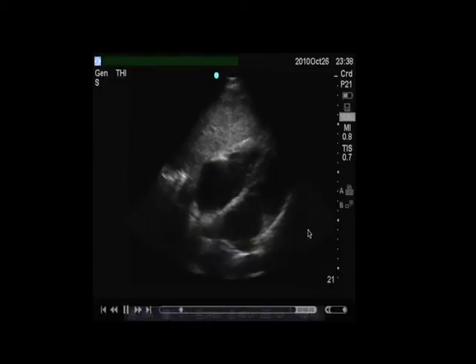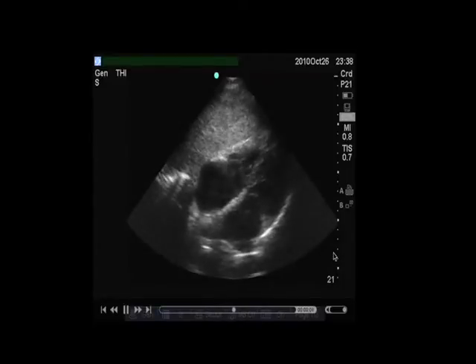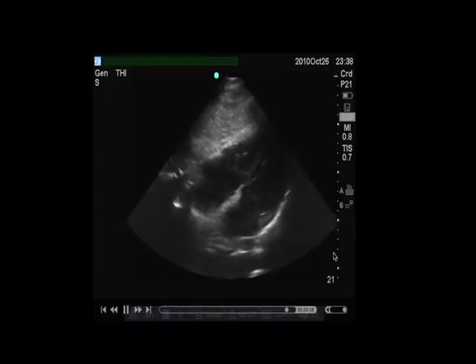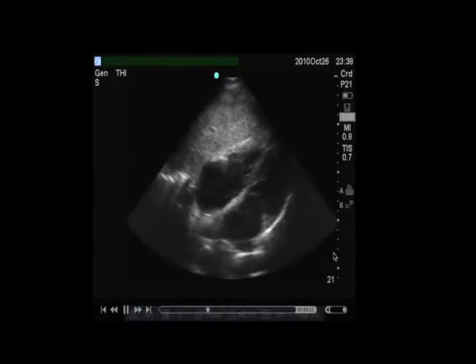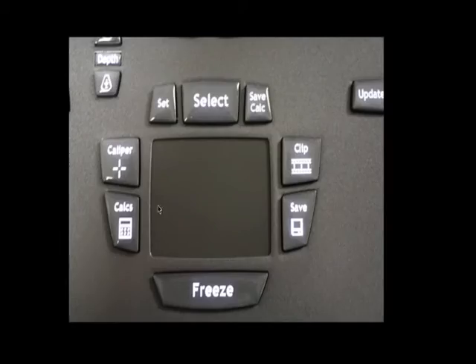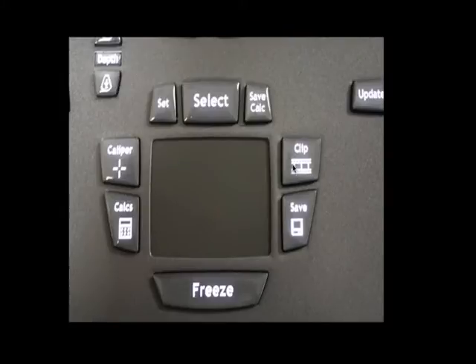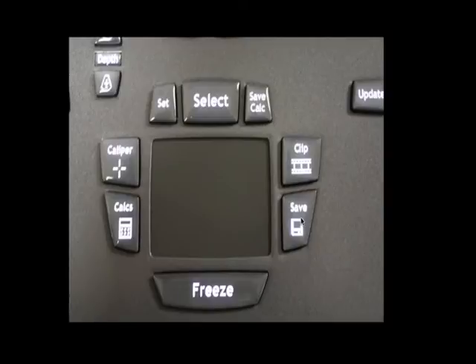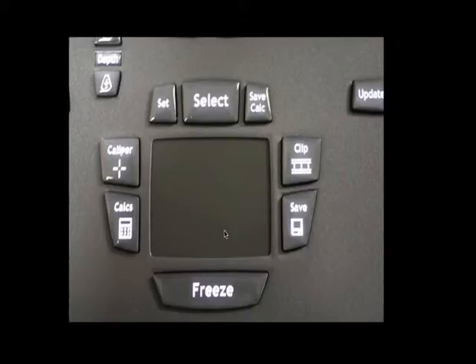So now you start scanning and you start capturing some interesting images, such as this one here of cardiac standstill. You are going to change your management of this patient based on this image, so you rightly decide you want to capture it. Find the trackpad in the center of the dashboard — immediately to the right of the trackpad you'll see two buttons: the clip button and the save button. The clip button corresponds to saving a clip, typically a short movie between four and six seconds depending on the preset. The save button saves stills only — still images in the form of JPEGs. You can press this while scanning live, or you can press the freeze button and scroll through the past several hundred images in the internal memory on the trackpad to find just the perfect shot before you press save.